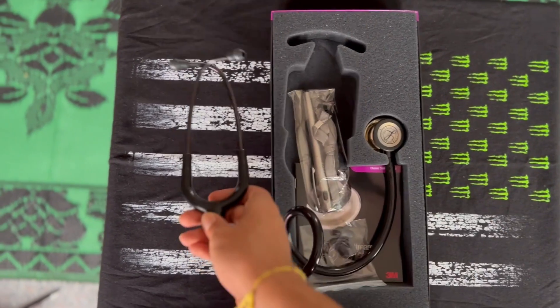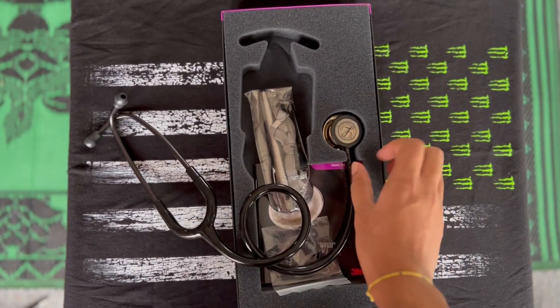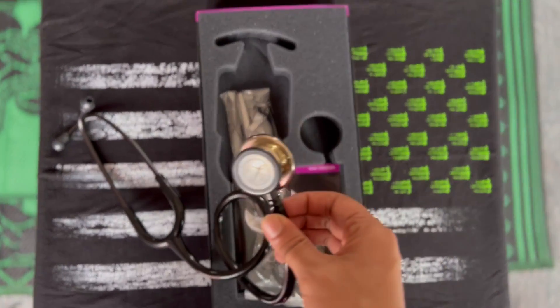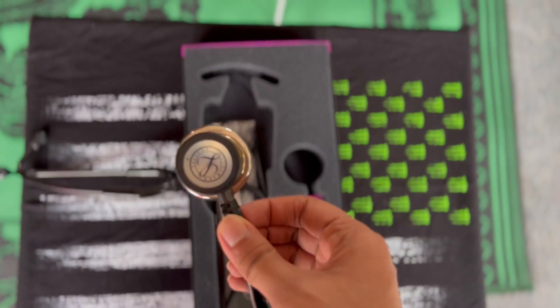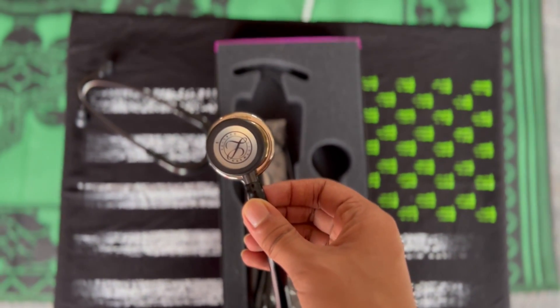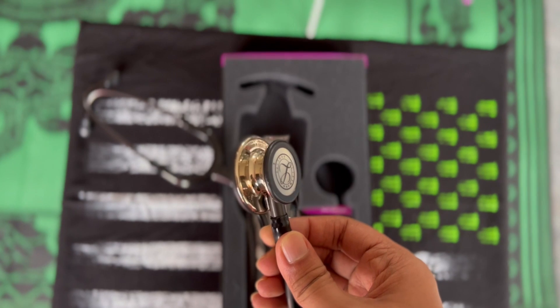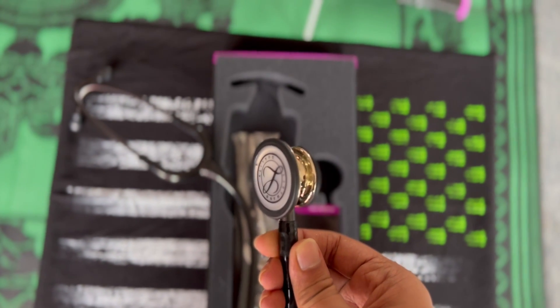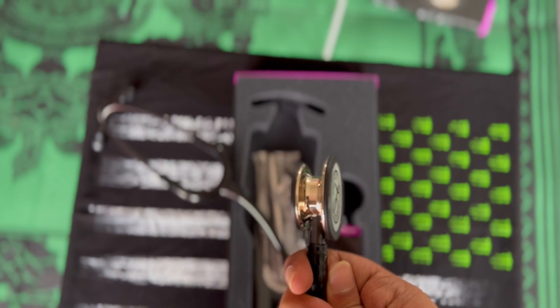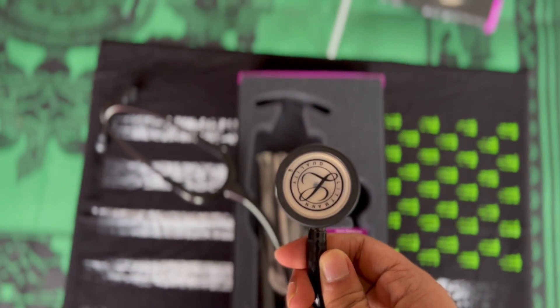Wow, it's actually here. Just looking at the diaphragm — it is a nice champagne color. I did get it engraved, which I'll talk about a bit later on. As you can see, it's slightly goldish, slightly silvery, giving it that classy look.